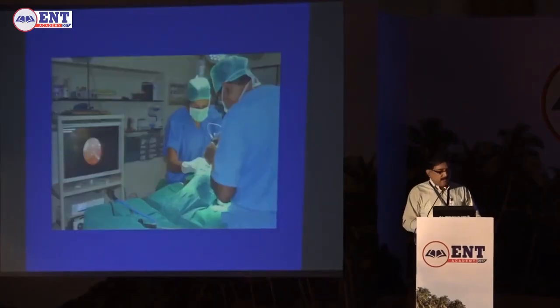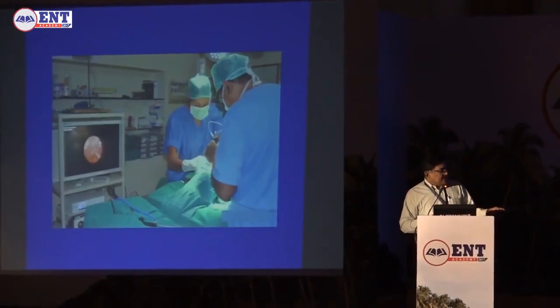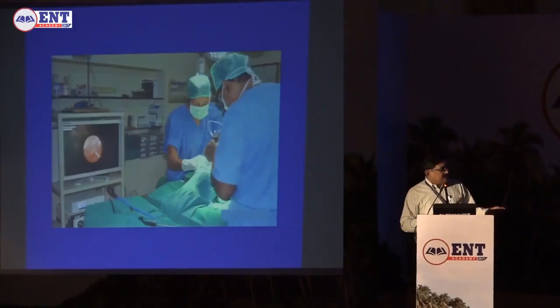So this is how we are doing. Most important to know that this endoscope has a flexible portion and a rigid portion. The flexible portion is connected to the camera, which is connected to the scope, and this portion is kept on a well stabilized OT table with a cloth, and the telescope is clipped to the cloth so that it won't fall down when you are doing it.